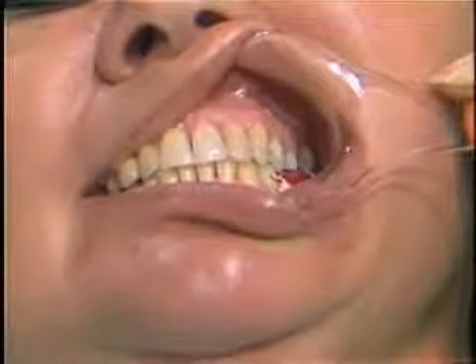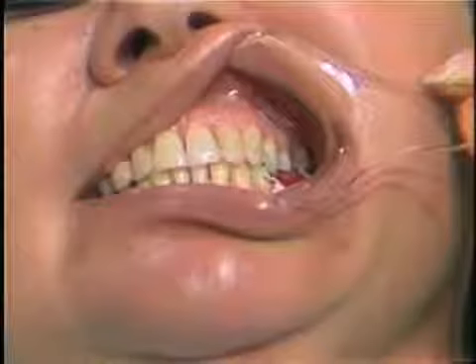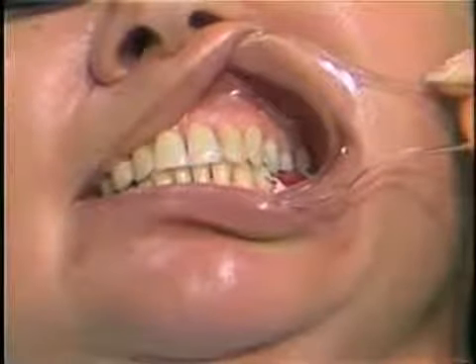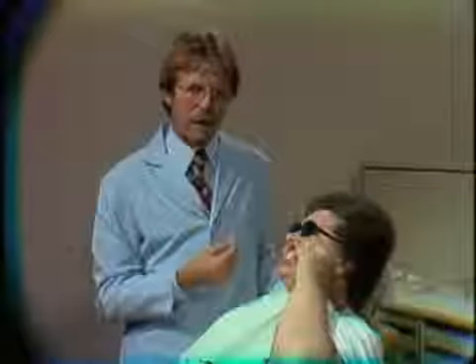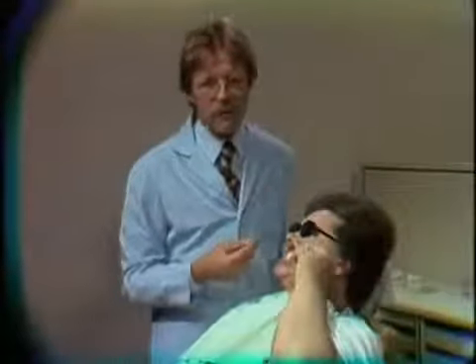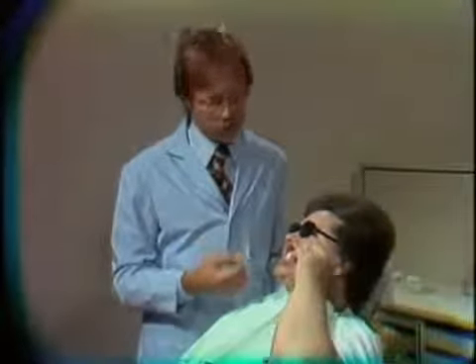It is also an acceptable procedure, although the Pex Purple wax is much harder, and you have to be ensured that the hardness of the wax has not done any of the guiding for the patient. The patient has to have the guidance come from their own dentition. This is the beauty of using the soft wax in place of the hard wax. The soft wax is used more for chairside functionally generated path procedures.